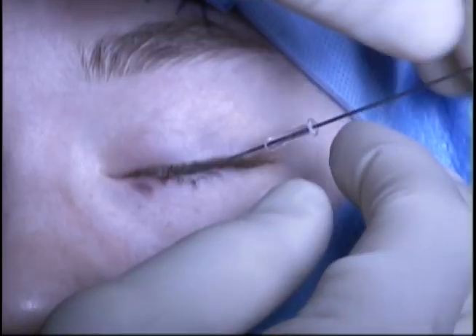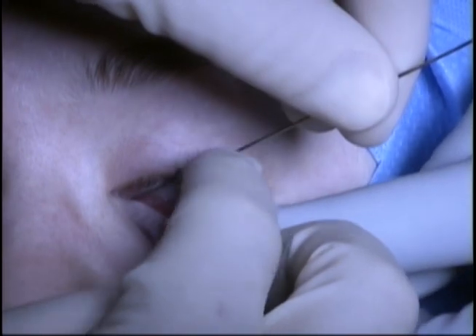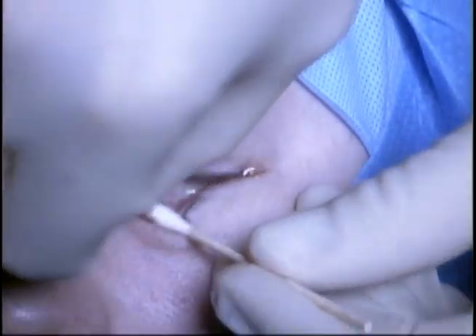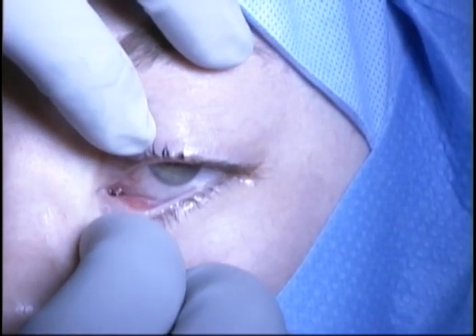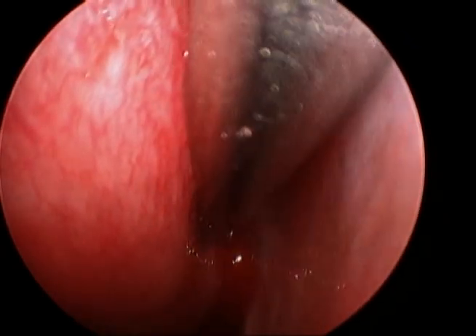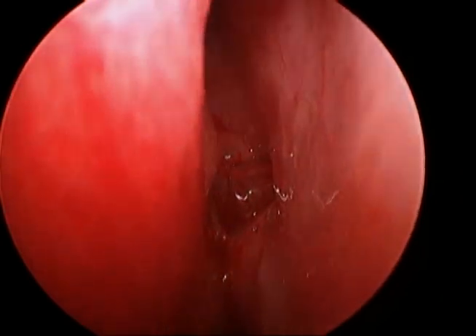A shorter tube is placed over the probe and can be advanced through the passageway into the nose. Externally, the Jones tube appears to be situated well. Intranasally, the tube appears to be in an appropriate position and is no longer obstructed by the nasal septum.